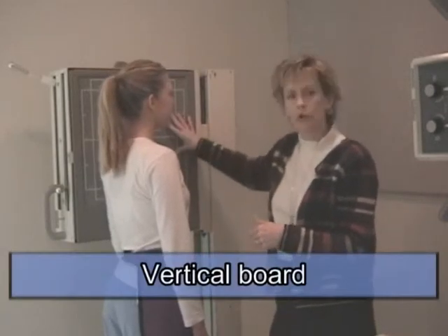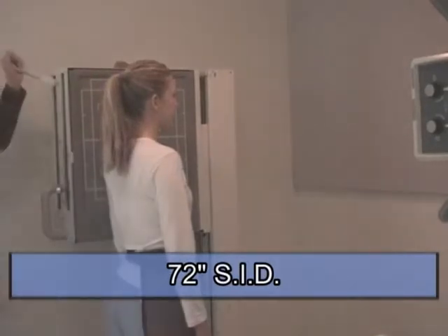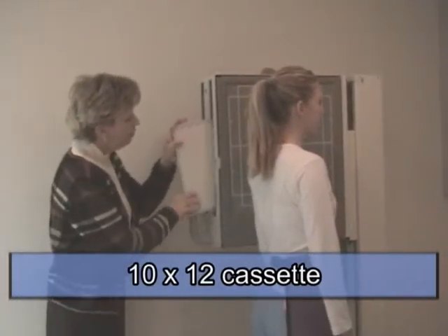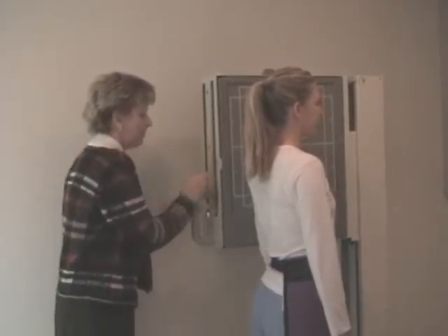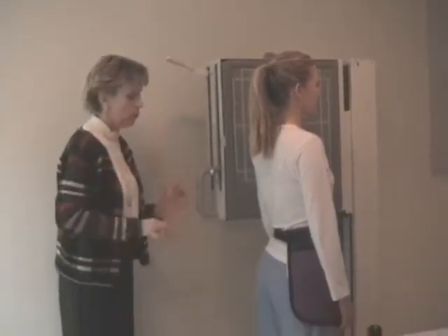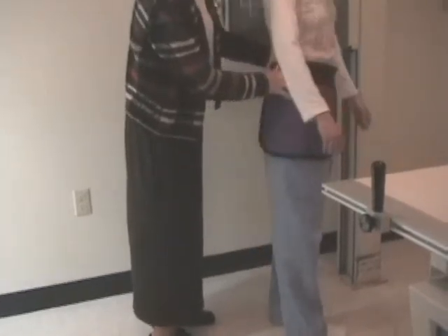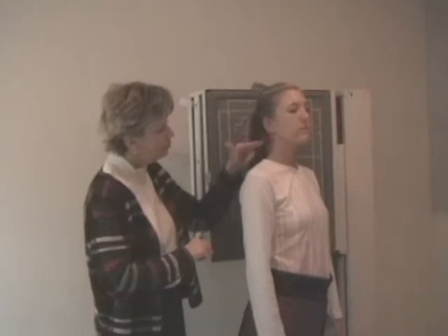I'm using the vertical board, and I have 72 inches SID. I have a 10 by 12 cassette in the wall bucky, ID blocker to the top. My patient's feet are separated so she has more mobility. Kristen, let's let them look at you for a second. Elevate your chin. Take a look at the space between her chin and her shoulders. There's quite a bit of space.